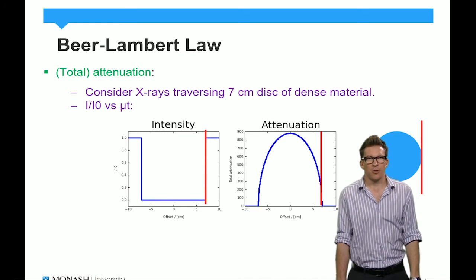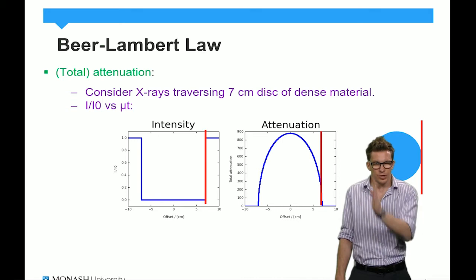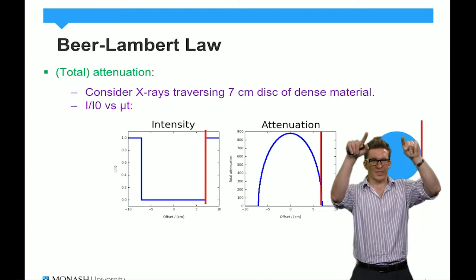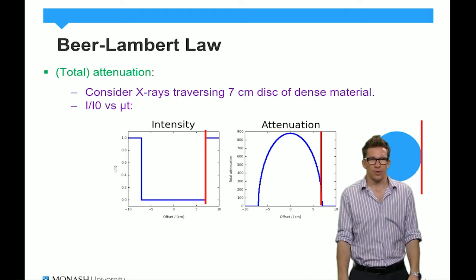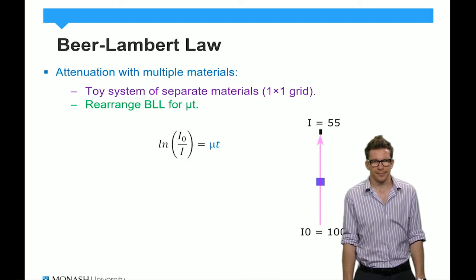So almost no X-rays are coming through the object, even when we're just clipping the edge of the object, and that's because it's a very dense material. If we used a less dense material, the intensity profile wouldn't have that harsh box-like edge and would be more rounded at the edges, as more X-rays would go through the edges compared to the centre of the material.